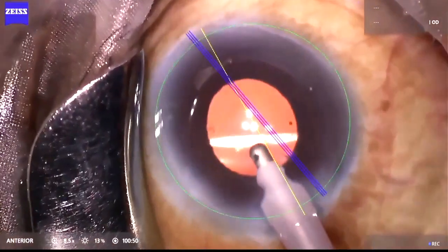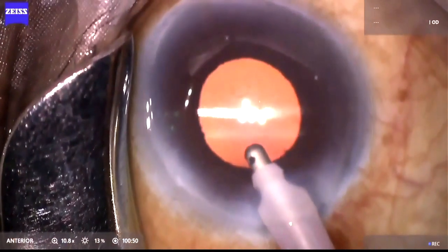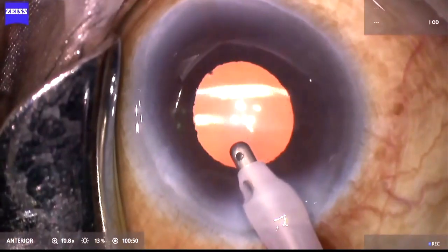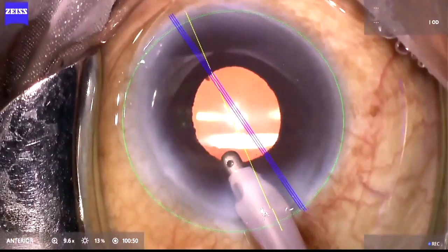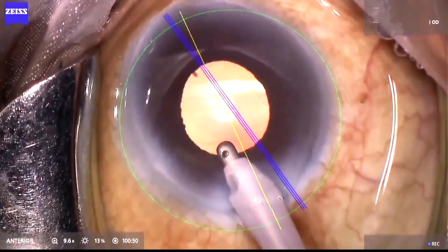This is a real case scenario wherein this marker was used in a case of a mid-dilating pupil to create the indentation mark, which was then aligned to the Calisto overlay, resulting in a good outcome.